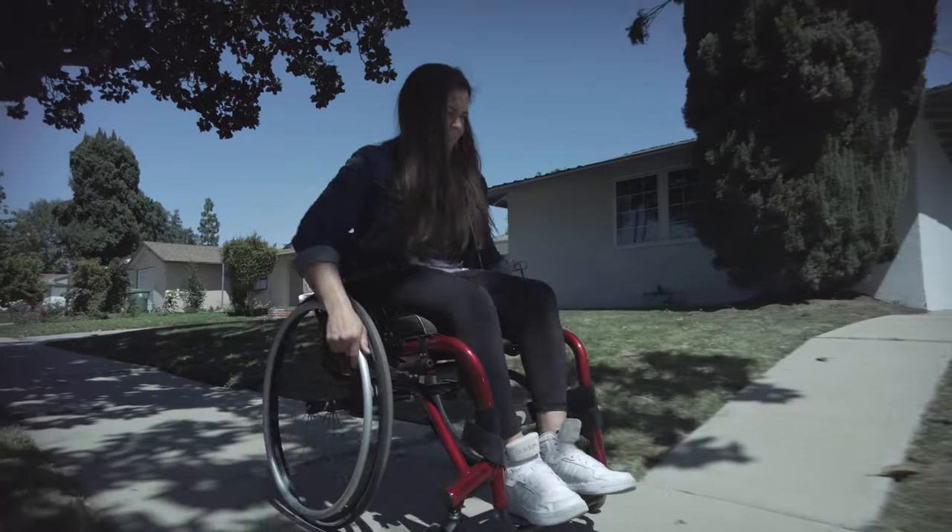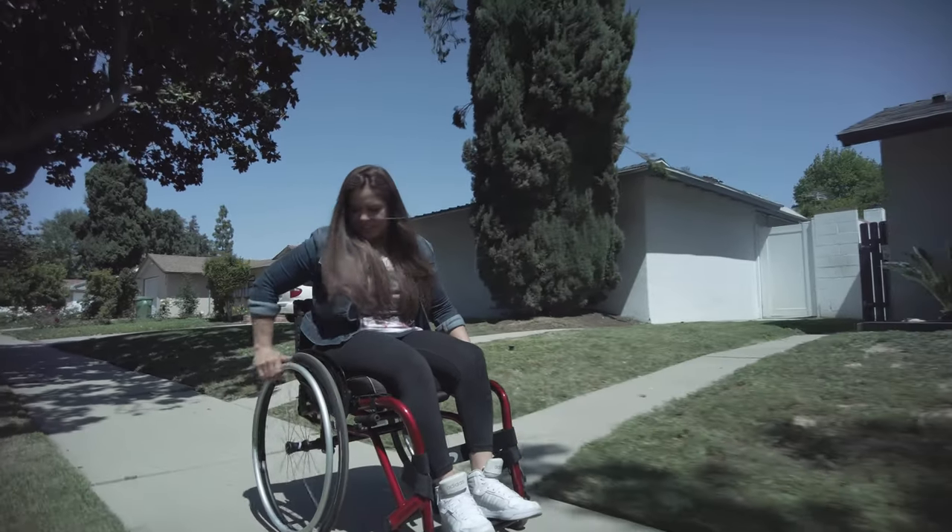We're super excited about the introduction of the Nitrum chair to the market, because we feel it's the next generation ultra-lightweight rigid wheelchair. It basically took everything that was good from the older product, and we took the voice of the customer and combined it — that's where the Nitrum came about. There are two versions: the open cantilever frame Nitrum, and the Nitrum Hybrid, which uses our dual-to-box technology.